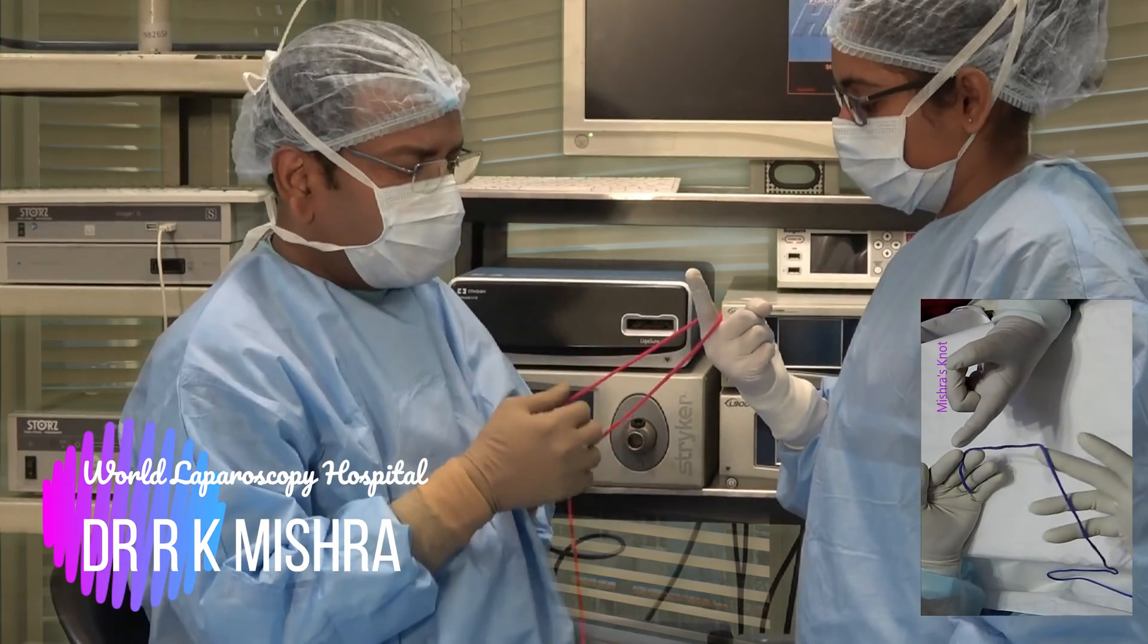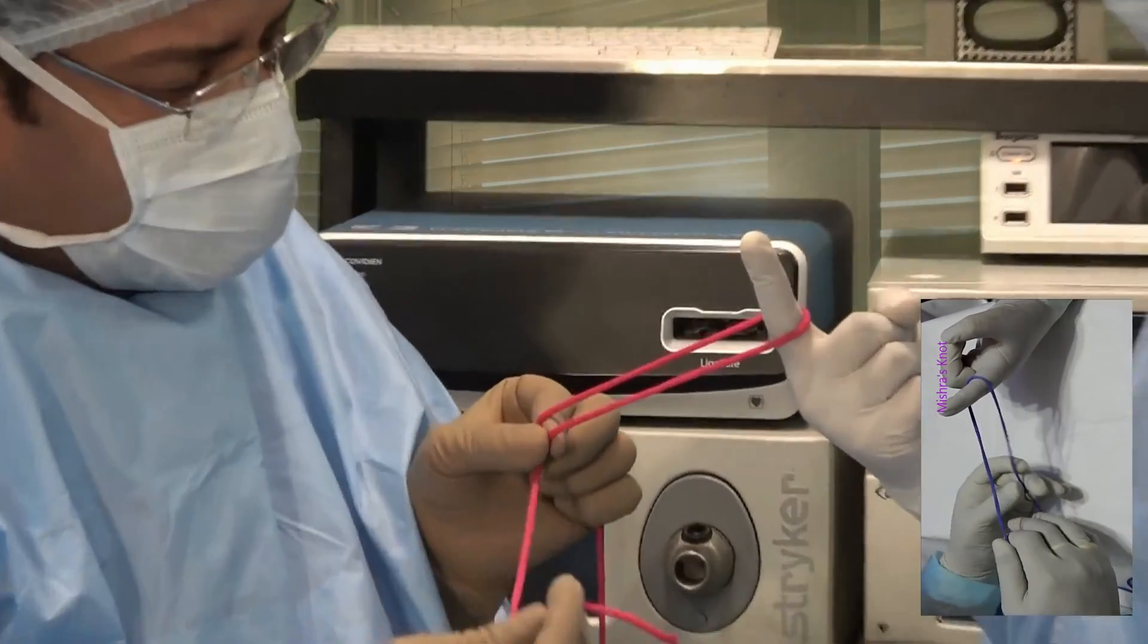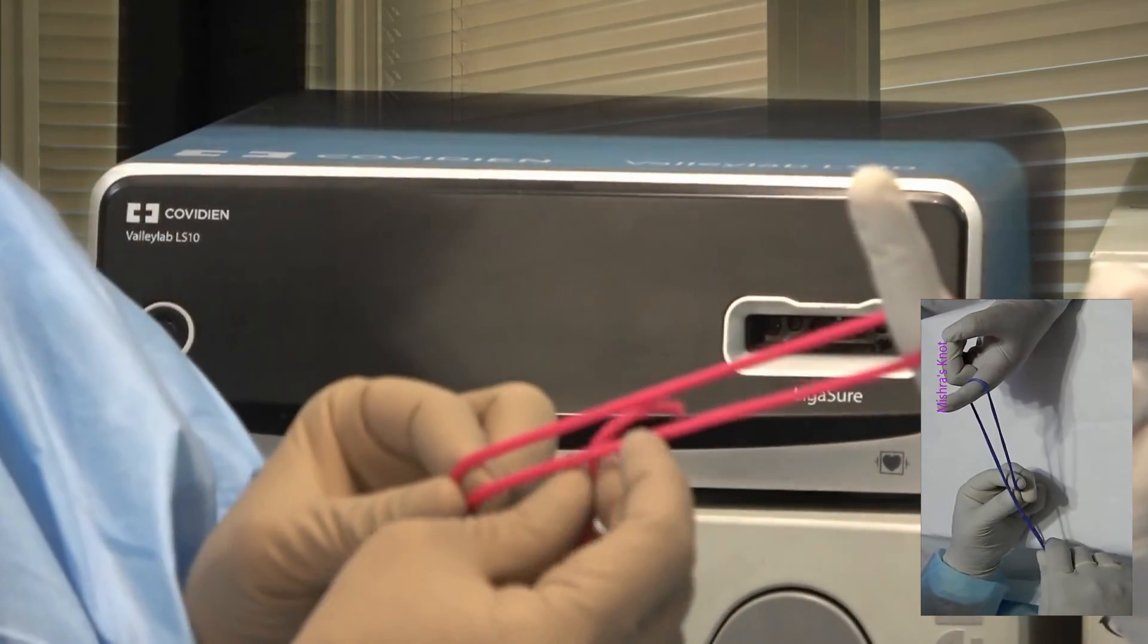You will ask the assistant for the finger and the shorter will be over the longer. Just like Roeder's knot, here also a single hitch will be taken first.